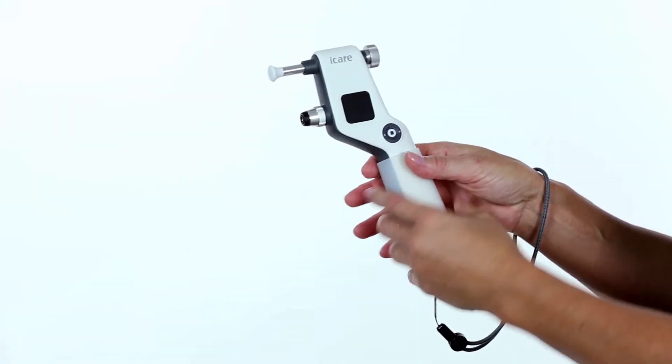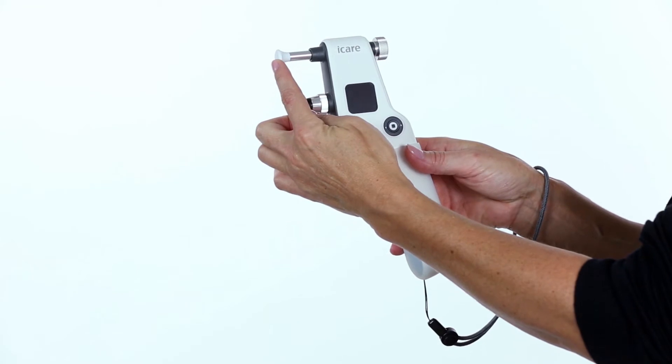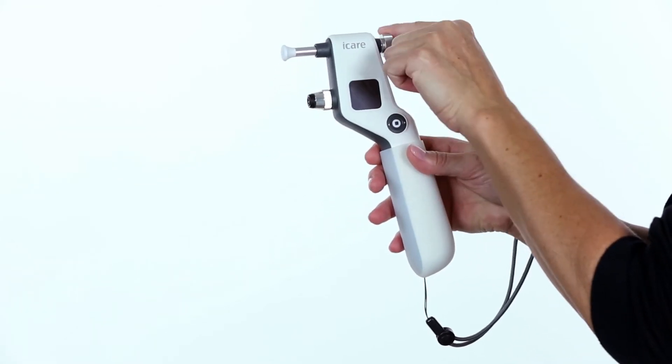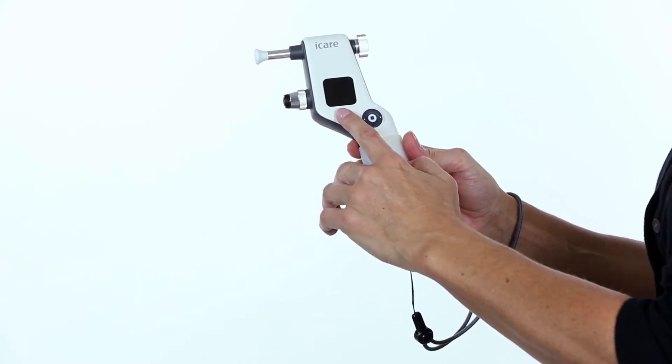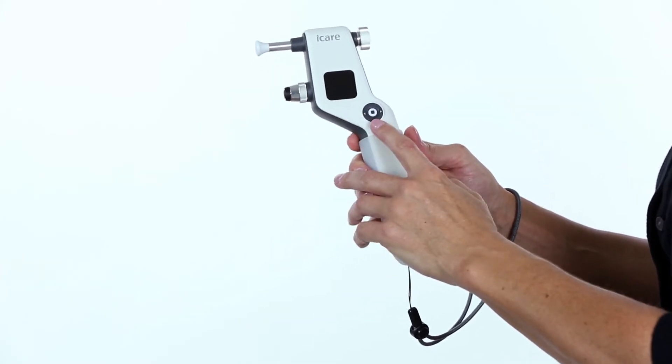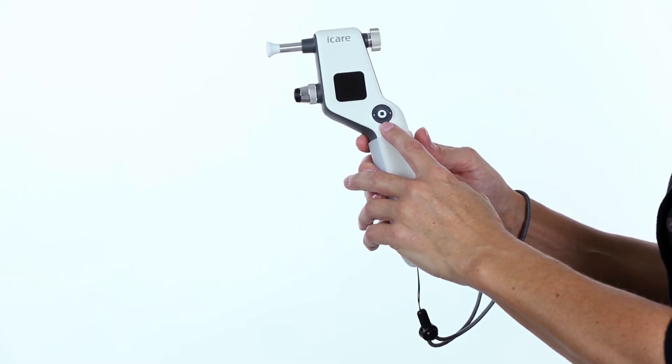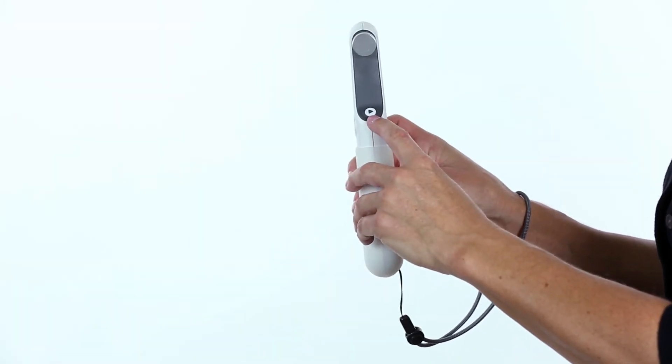Parts of the IC-100: This is the forehead support, forehead support adjusting wheel, probe base and collar, display, select navigation button, and the measure button.